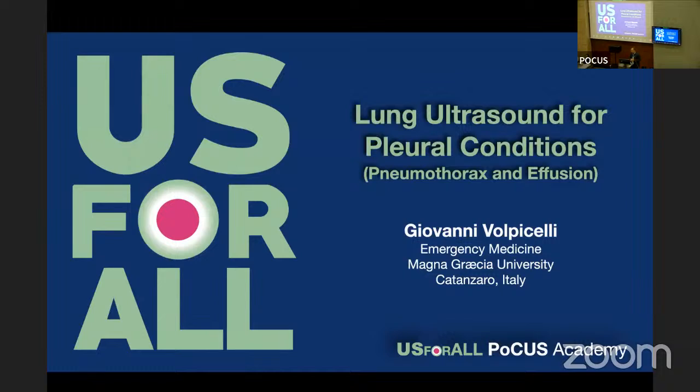When we use the linear probe, the cutoff shown in the literature is different, because there are studies from the German groups showing that using the linear probe, the cutoff for positivity is 6 B-lines and not 3. So it's double. But I can tell you that no one in the world will use the linear probe to assess aeration, B-lines, and congestion. The linear probe was only published for fibrosis studies by the Germans. So usually we use the convex probe.